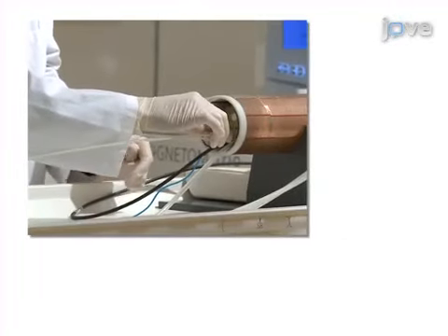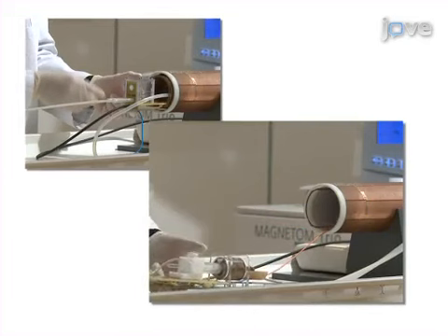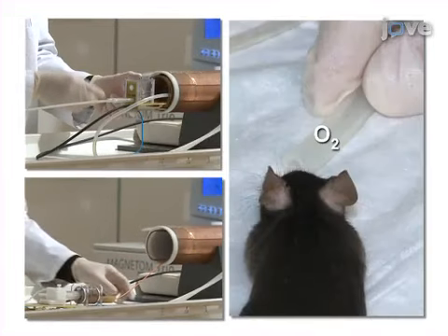The final step is to remove the mouse from the MRI scanner and to support its vital functions for rapid recovery from anesthesia, which allows for repetitive MRI studies of the same animal or subsequent behavioral or histological examinations.